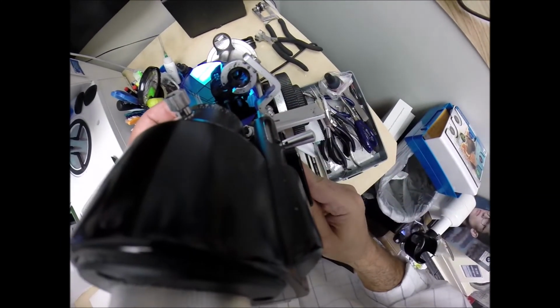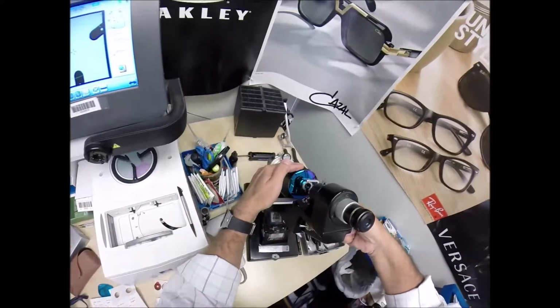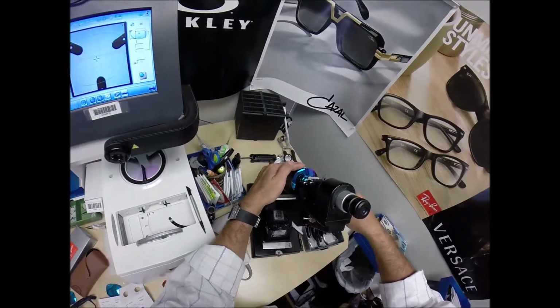Put the lens in, spin it until the spherical component of your prescription comes into view first. Check your astigmatism correction. I'll explain what all that means later. I'm going to put three dots on your lenses.